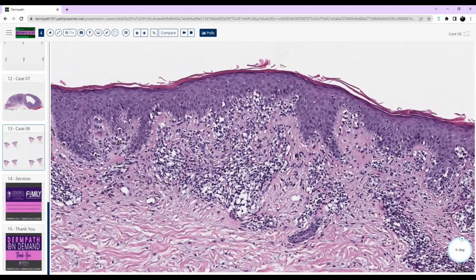Well, so you already kind of mentioned one, like the eczema. If there weren't as many lymphocytes and there was more spongiosis. Yeah, but that was too easy. Yes. We want to really trip up our colleagues here. We want to make it a really, really tough question. So we're not going to put atopic dermatitis down. We're going to put some other things that really can look very, very similar to MF. There's like the slack skin.